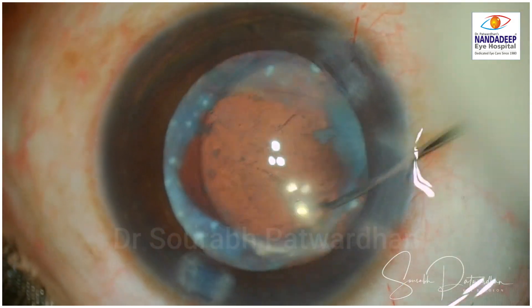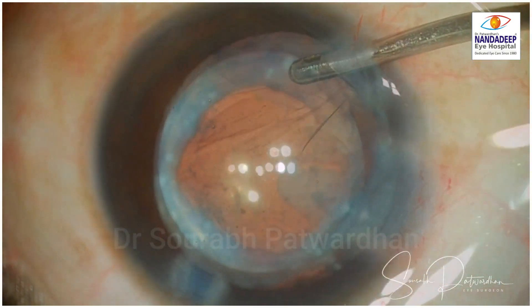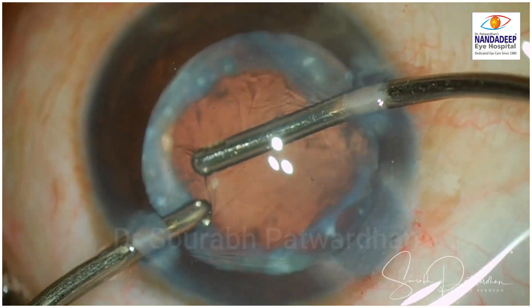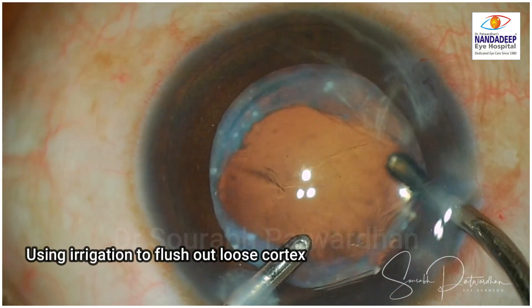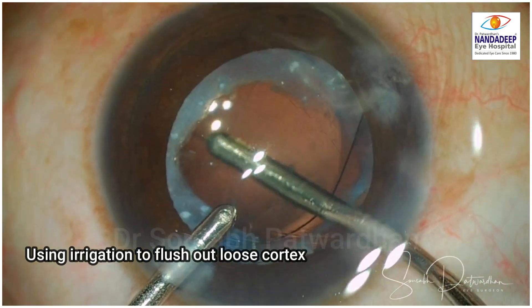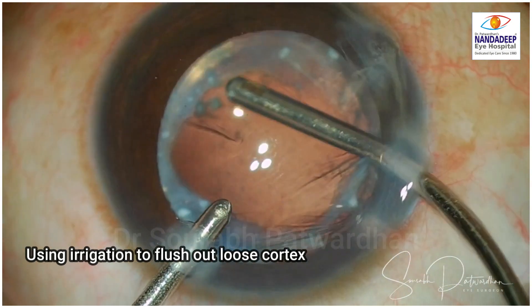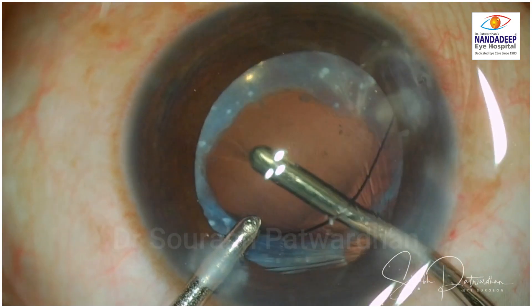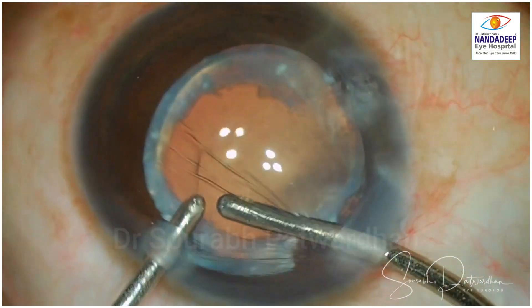This is another way to tease out the cortex. I have injected the IOL in the bag and now I am rotating it 360 degrees. What these haptics do is tease out the remaining cortex from the equator of the bag, which is otherwise very difficult to approach. Again I am using just irrigation under the capsule and under the IOL so I can remove the viscoelastic as well as the loose particles. In these cases there will be some cortical fibres left all around because they are sticky and we may not be able to remove it all.